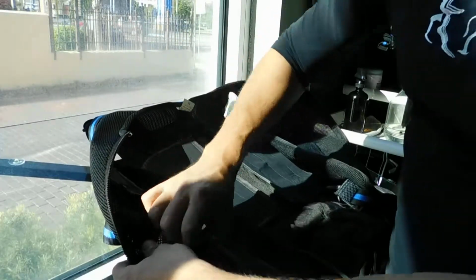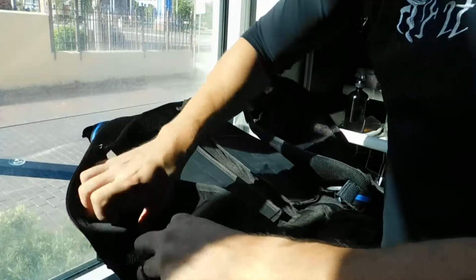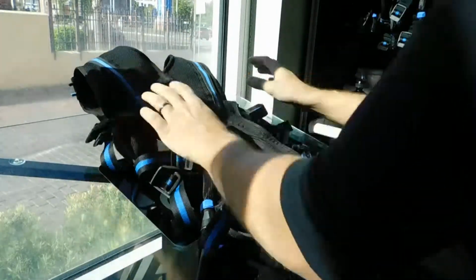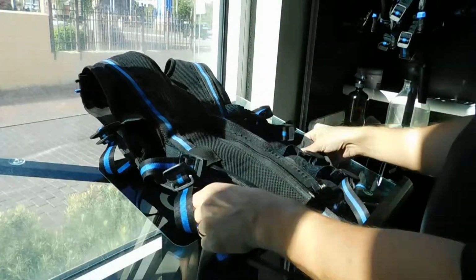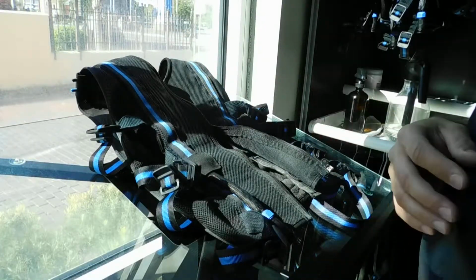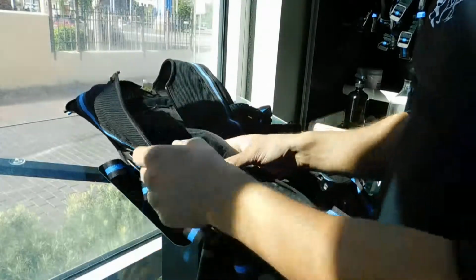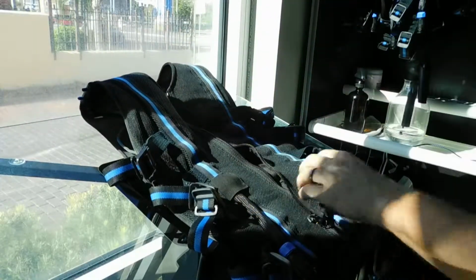And then it's good if this Velcro is put down nicely right on it. Good. So it covers the whole thing. Perfect. Okay? So that's one, right? So that's probably the reason, by the way, why the ab is cutting out. So make sure you go through it and fix it and move it around and all that. And then, worst case, I'll also show you on the other cable.